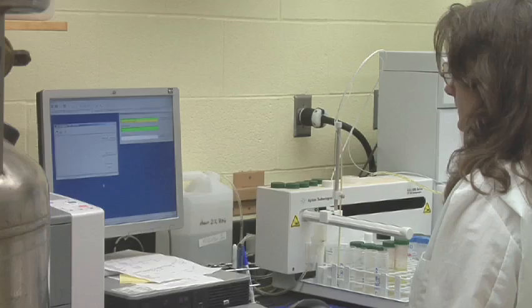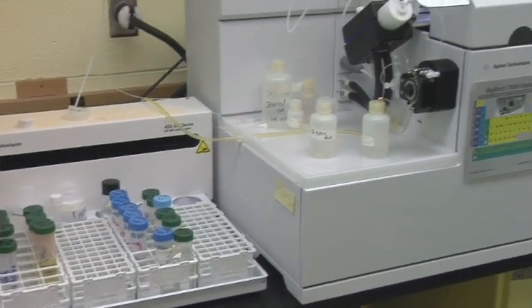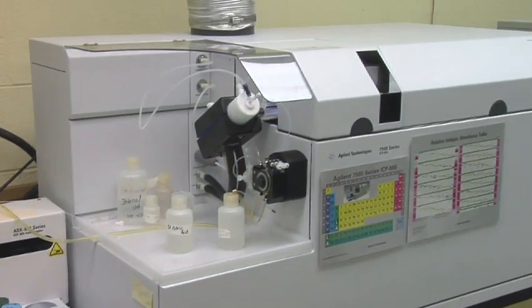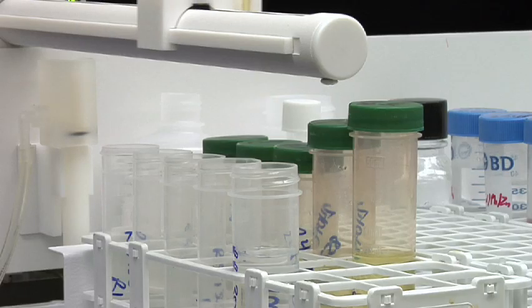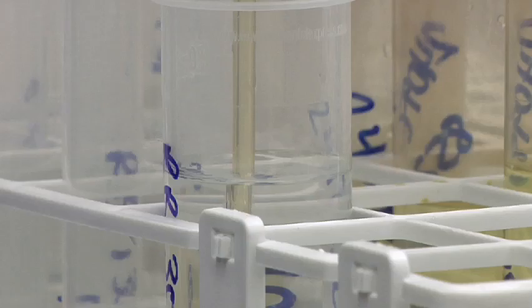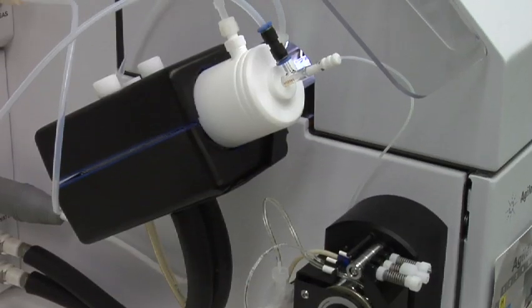The labs at KSVDL work to provide services using the latest equipment and technology. The toxicology lab's recently acquired mass spectrometer generates detailed chemical analyses of fluids, tissues, and suspected hazardous sources. The nice thing is that now we can do it in-house, where previously, we would have to send it out to Michigan, and that could take anywhere from a week to 2 weeks. Well, if you've got a real problem, you need to have that information as soon as possible.